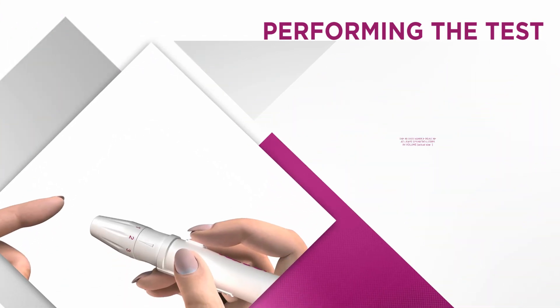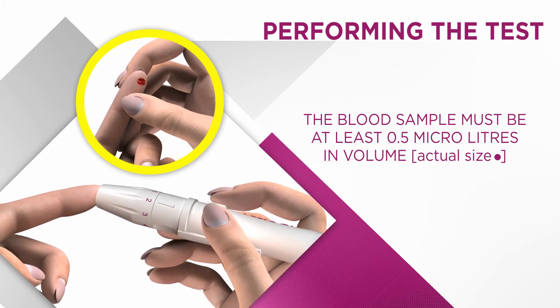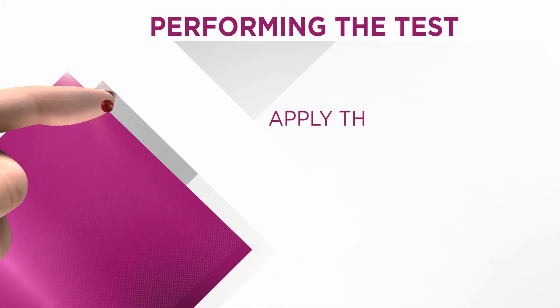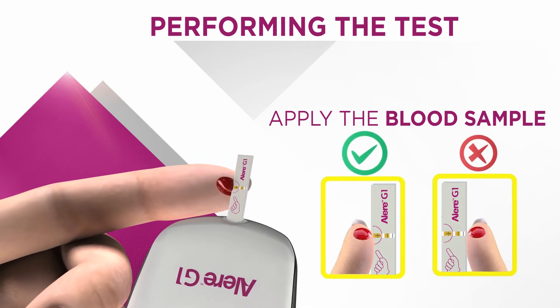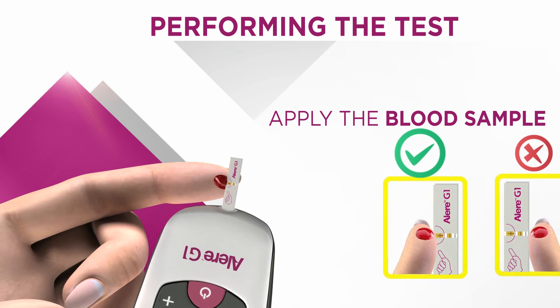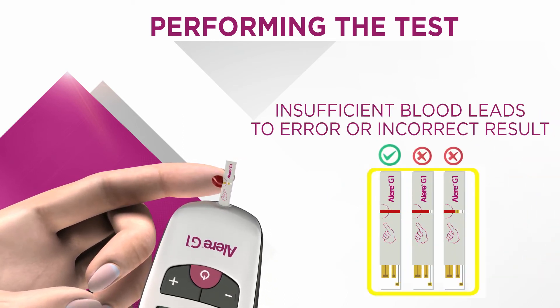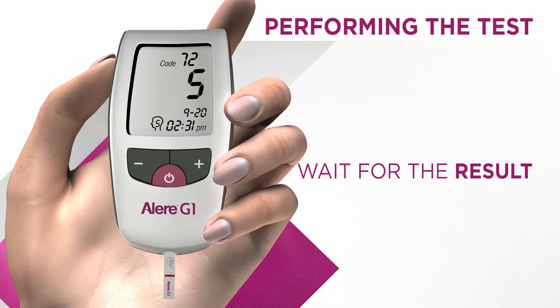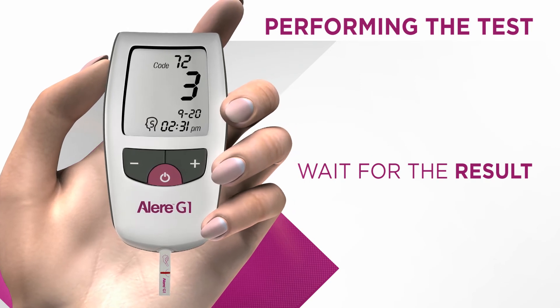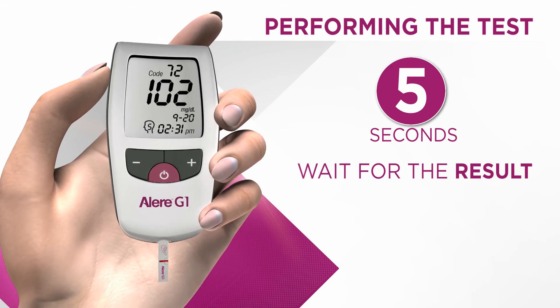Lance the fingertip on the side and form a small drop — only 0.5 microliters is needed. Apply the drop onto the side edge of the sample window and hold on till the monitor beeps. If there's insufficient blood, as indicated in the confirmation window, it may give an inaccurate result or an error. Discard the strip and start afresh. When blood is sufficiently applied, the monitor will begin the countdown and the result will appear in five seconds.